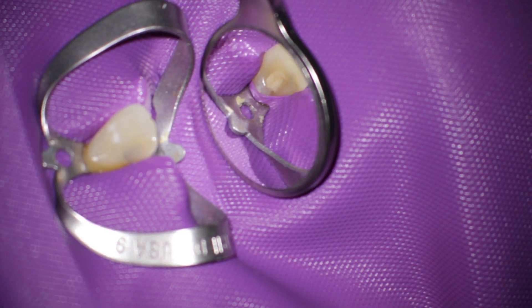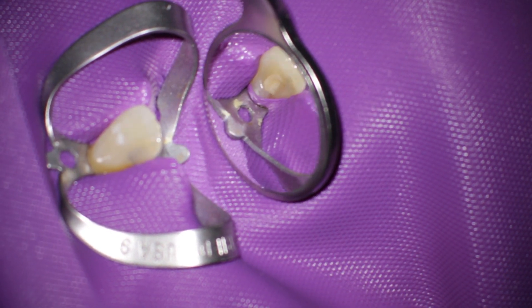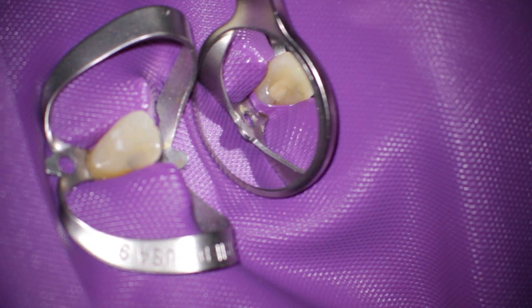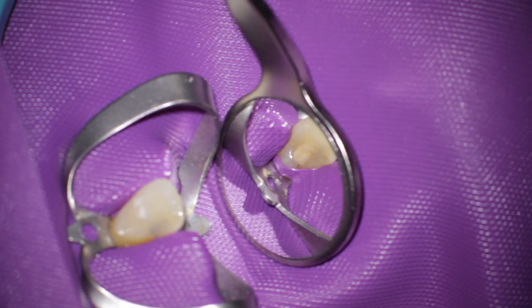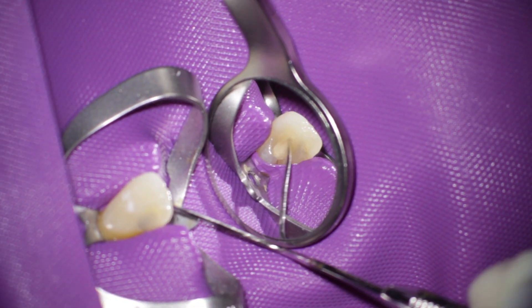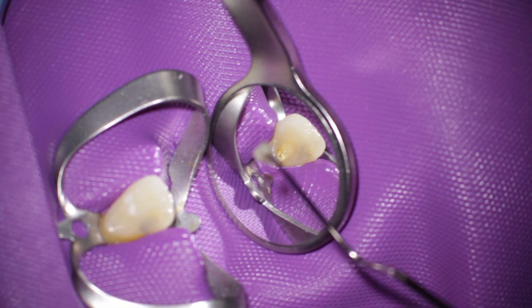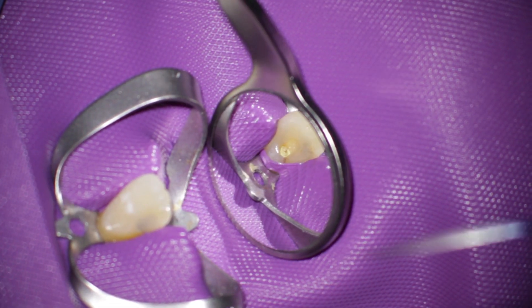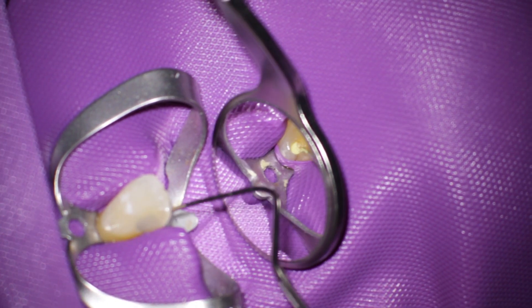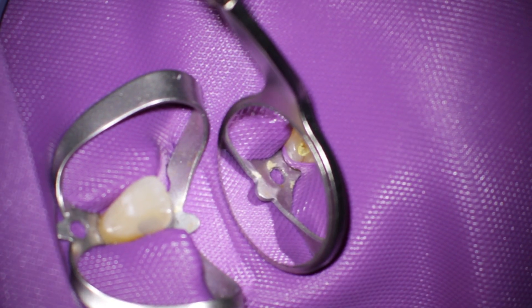Welcome to a new video. I'd like to show the endowag procedure and how you can have this endowag system a little bit cheaper than you buy it in the store or in the dental store.